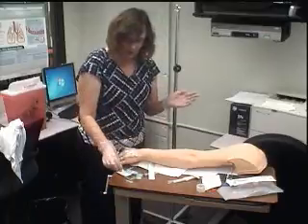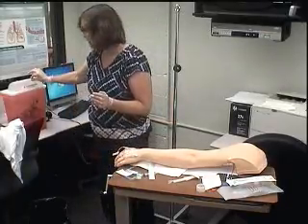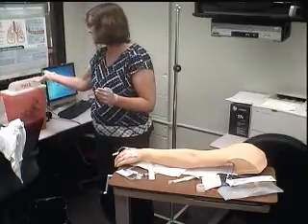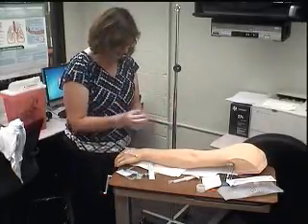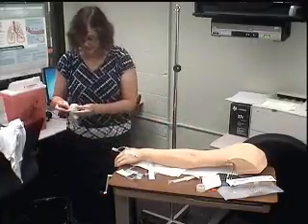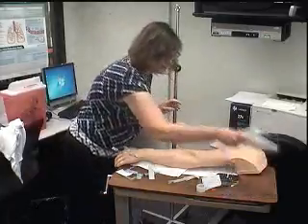Now we need to appropriately discard everything. So get this needle and throw it into the needle box. By the way, you notice how I'm throwing it in the needle box, I'm dropping it, I'm not shoving my fingers in there and closing it. All right, and I clean that. Now I still need to go ahead and just hang my IV fluids. All right. So wash my hands so I can hang my IV fluids now.